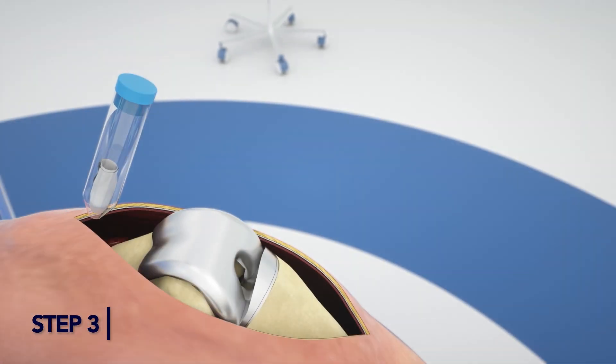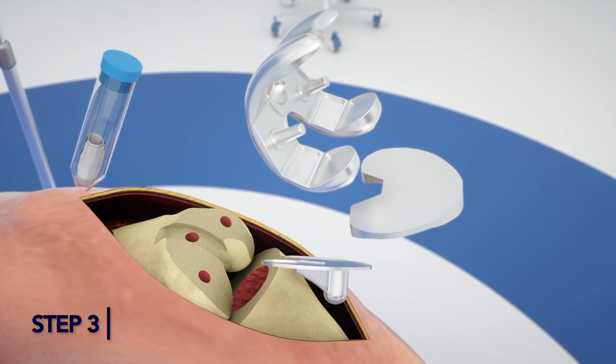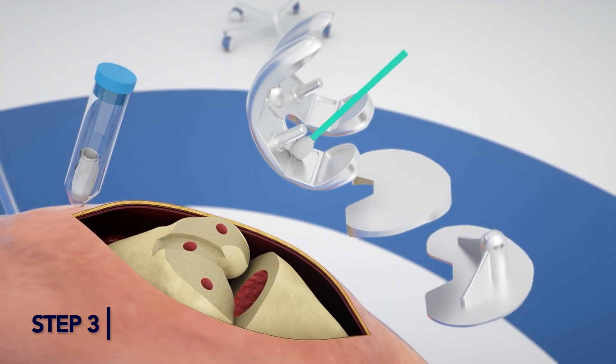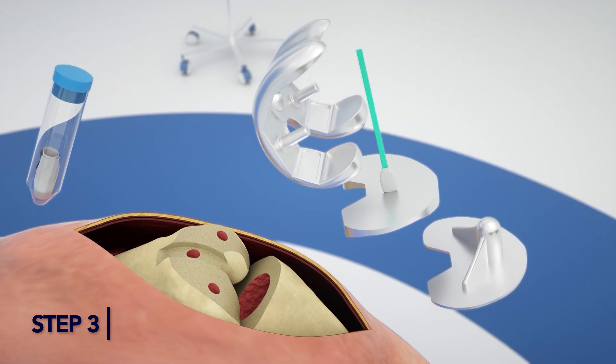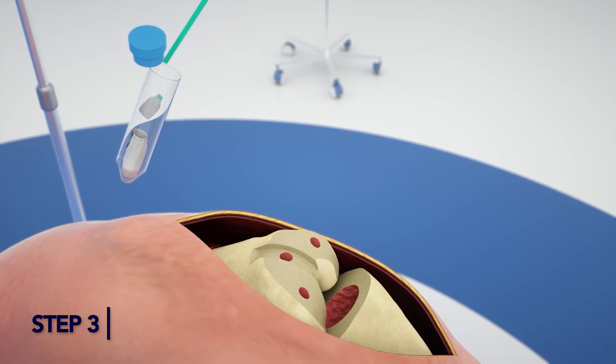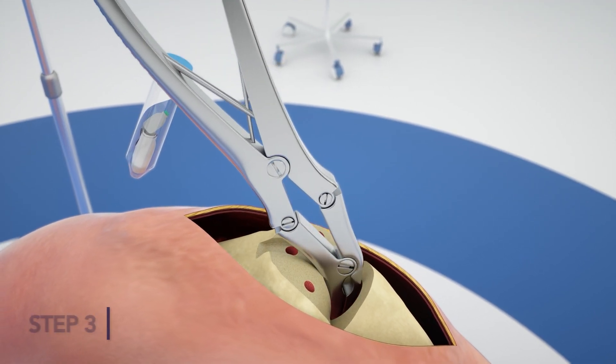Step 3. After removal of the modular component, use the Alpha Flat Swab, or a second sterile gauze pad, and thoroughly wipe the surface of the implants. Place the pad inside the second 50ml vial with the gauze. Break off the Alpha Flat Swab head.